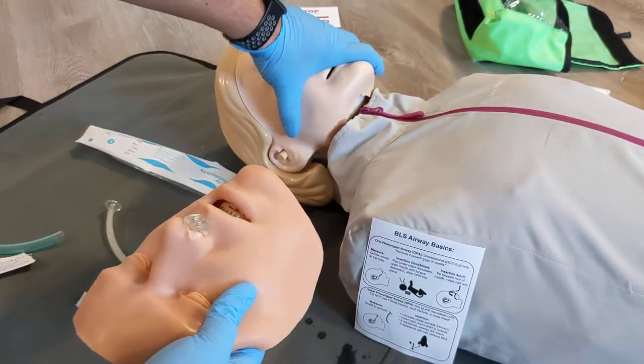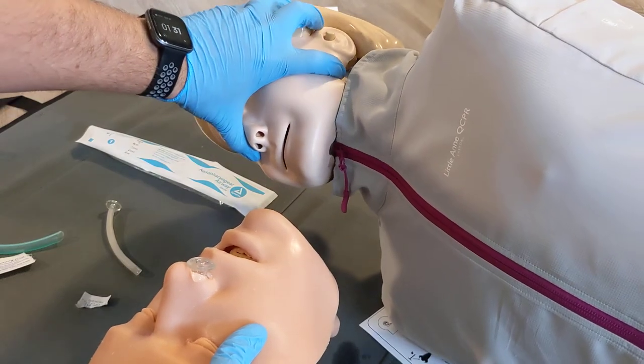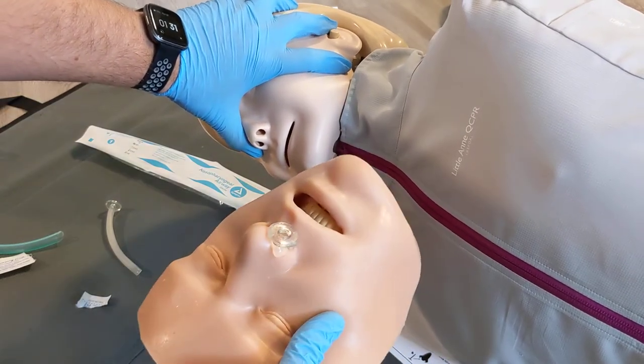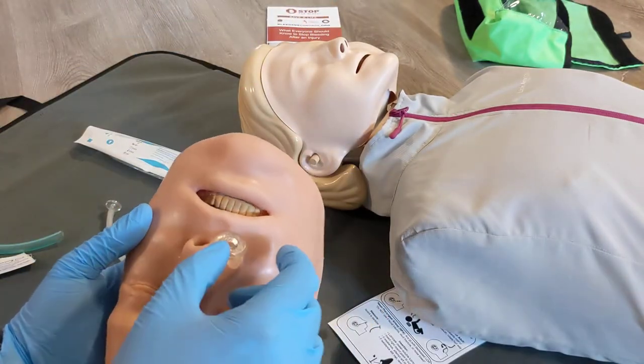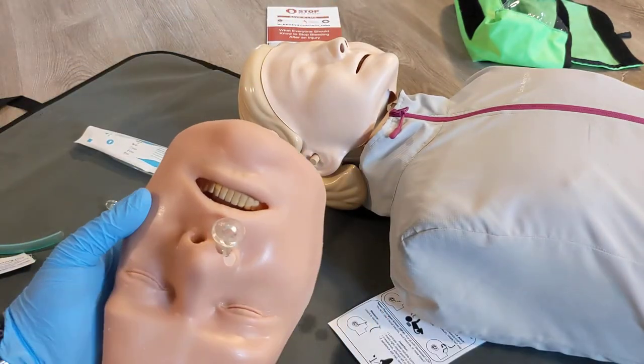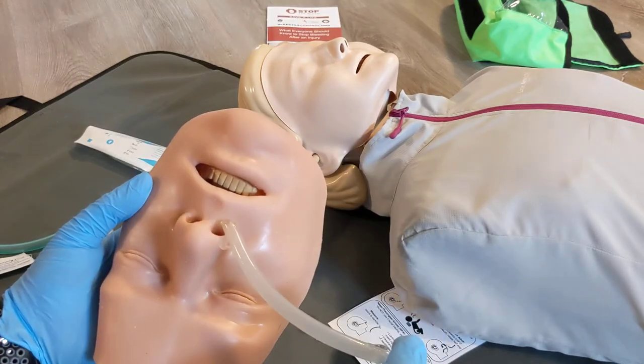This, in combination with patient positioning such as the recovery position, a jaw thrust, or head tilt, can really improve the airway and oxygenation of the patient. If the patient is gagging or having difficulty with this, you can withdraw it a bit. If it's still causing difficulty, you can fully remove the airway by pulling it out.